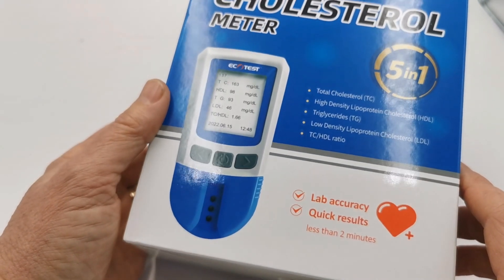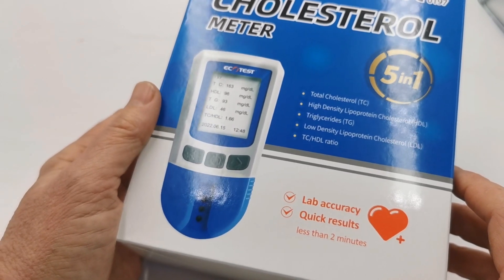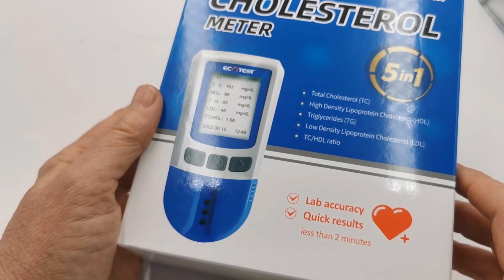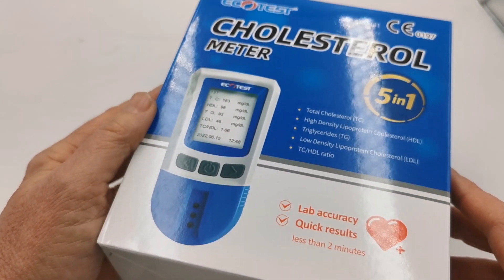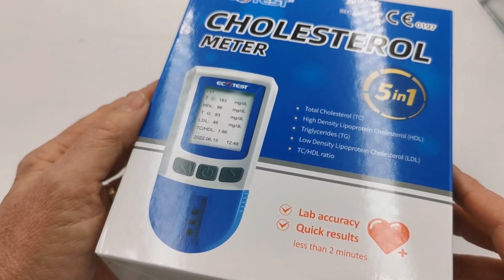Now if you're considering purchasing one of these meters, you probably have an issue with either elevated cholesterol, or maybe on dietary modification already or on statins to lower your cholesterol, and you're looking for a meter system which will allow you to monitor your progress. This is an ideal choice for you.